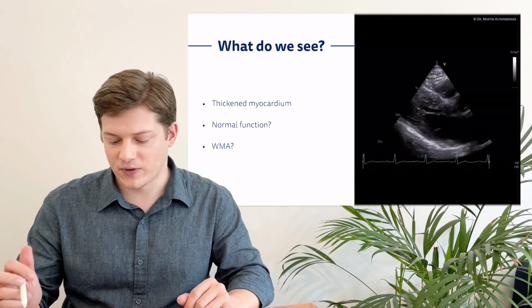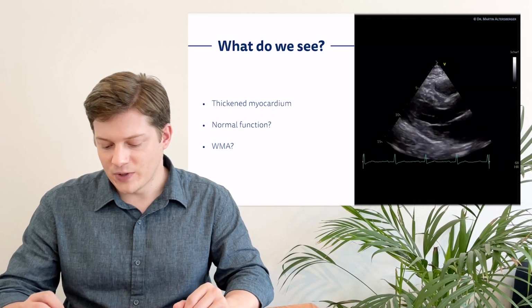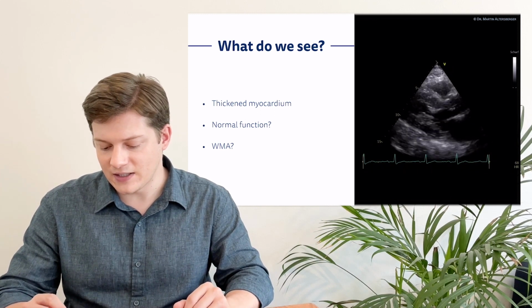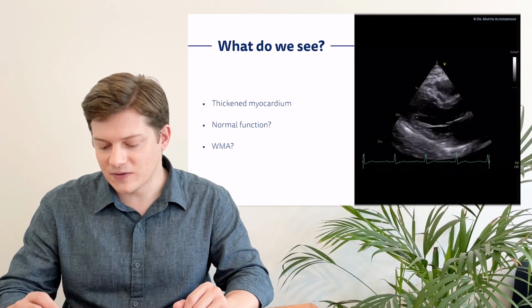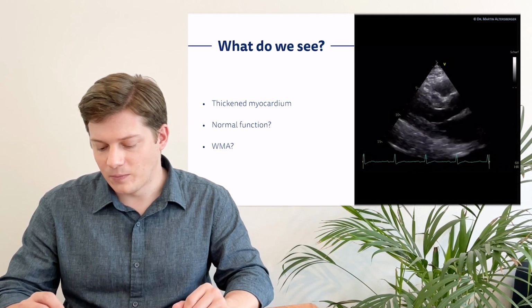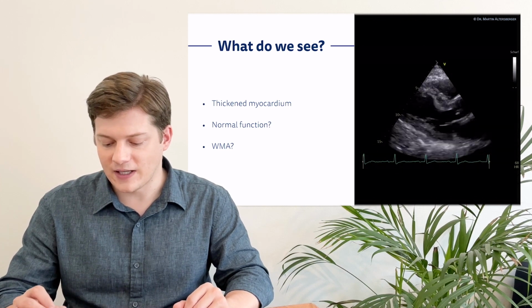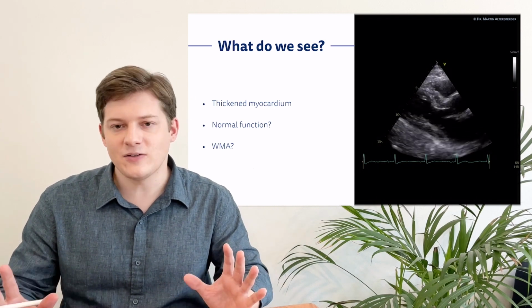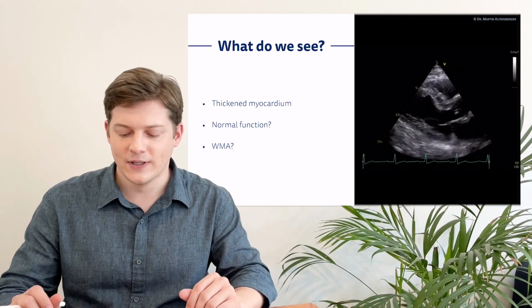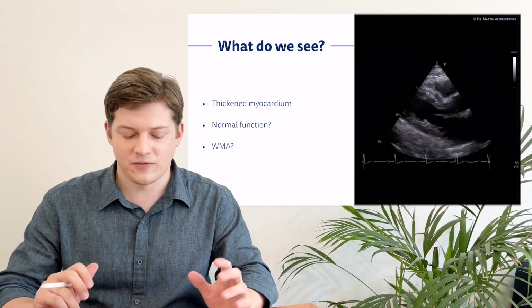In case of a pathology, we see here a loop again. We do see here the pericardium, this bright hyperechoic layer. There's the interventricular septum, the posterolateral wall, the mitral valve, the aortic valve, the LVOT. And this loop already looks entirely different compared to what we have seen before. But how is it different? Let's review what we do actually find.